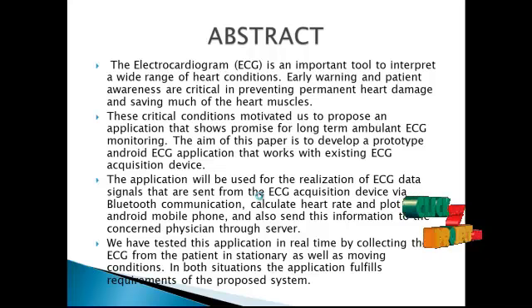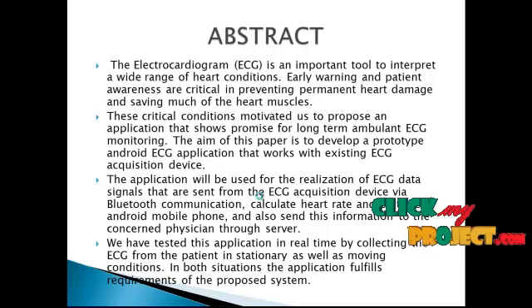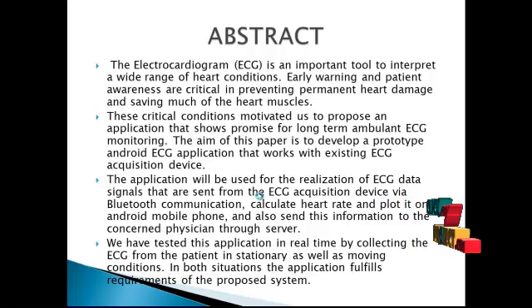It consists of the ECG electrocardiogram amplifier, microcontroller and the Bluetooth module. The ECG electrodes will capture the electrical signal and send it to the operational amplifier. The output generated by the amplifier is in analog form and needs to be converted into digital form.